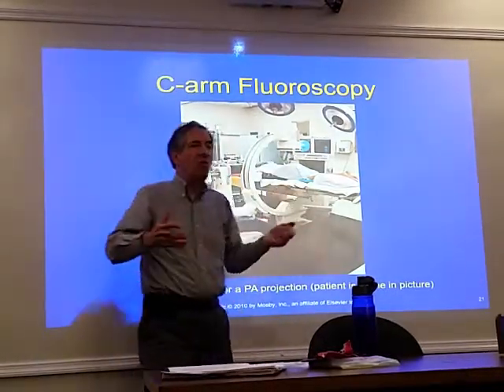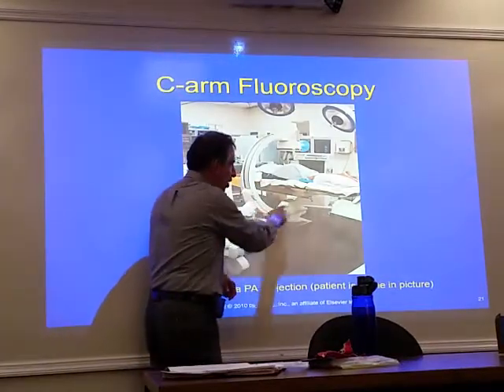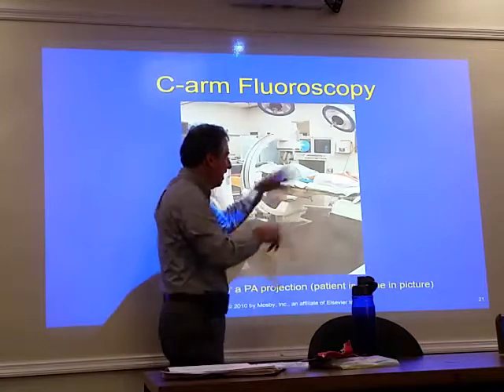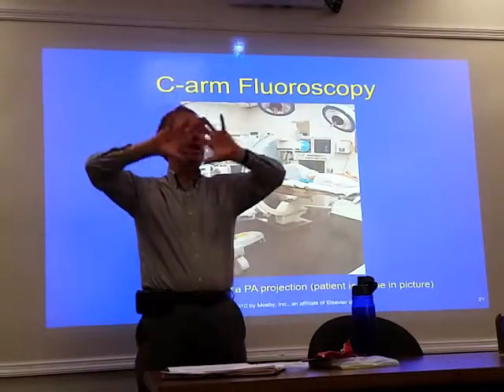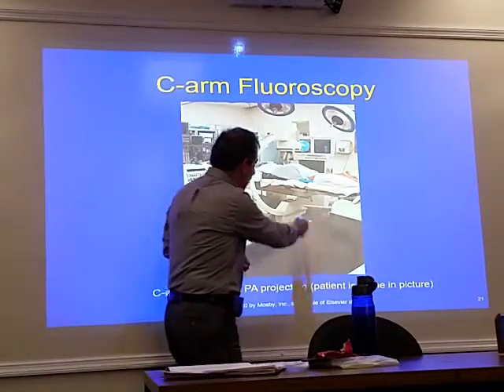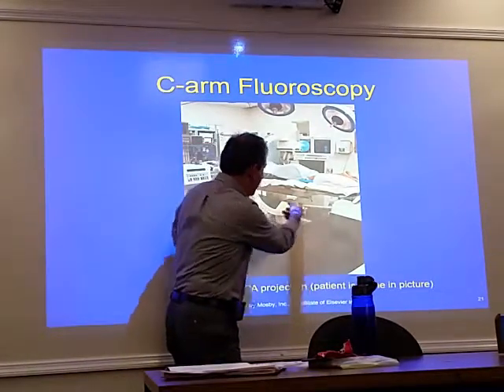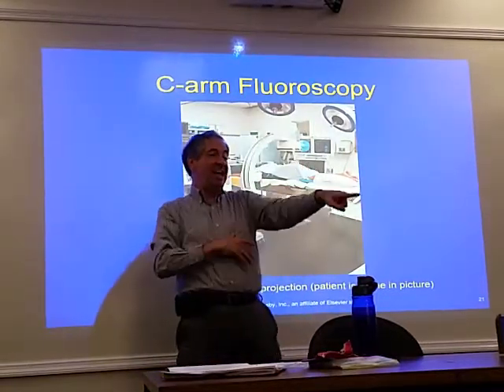You bring this out afterwards and you've got a lot of cleanup. If you put a baggie over this area, which a lot of times isn't going to go anywhere close to the sterile field, you take the baggie off and you are done, and it's such a quick cleanup. Can't tell you how many times something's on this end of it, you don't see it, and you go ahead and do your cross-table lateral, and they can see it on the other end, like, you need to get that clean.